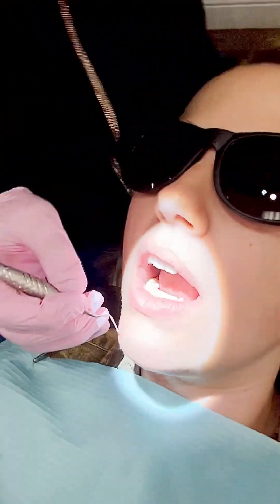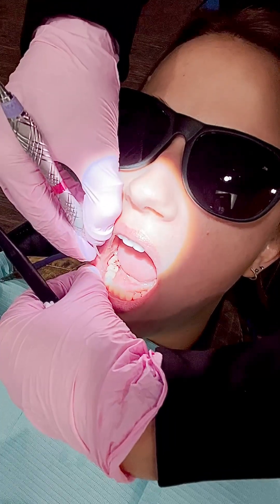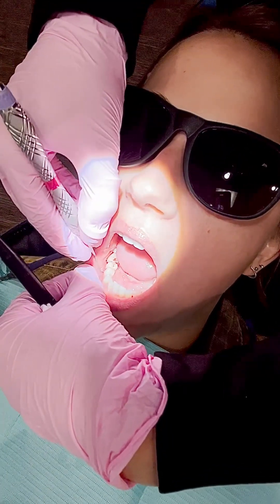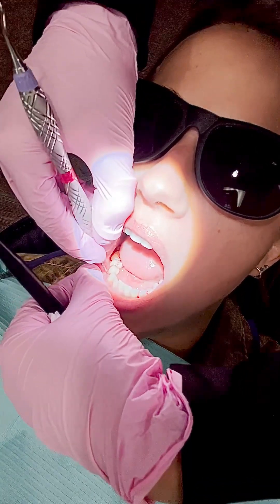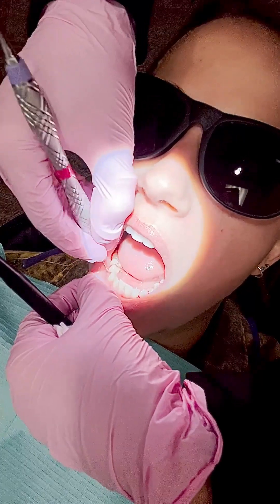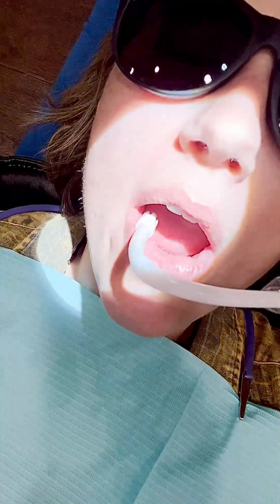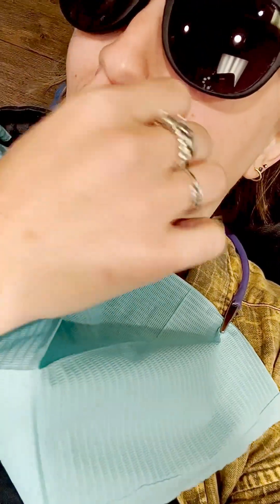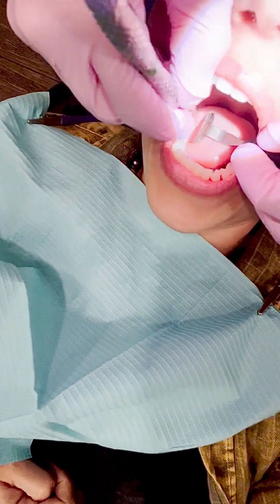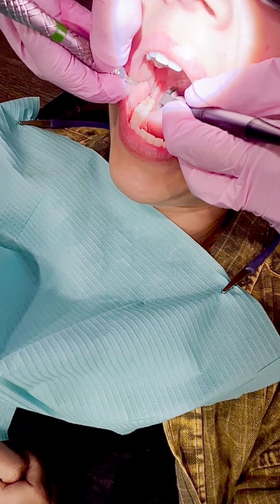Right now I'm coming from 9 o'clock. But if you want to scale the buccal area of the lower right molars, come from 1 o'clock. This is way easier than having to angle your wrist. If you're right-handed, it's way more ergonomically comfortable to scale the buccals, especially the premolars — you can clean the premolars really well from 1 o'clock. Now I'm going in and getting the lingual of the lower right molars, 30 and 31, staying at 1 o'clock. I'm using my double-sided mirror to retract the tongue and getting into those areas.